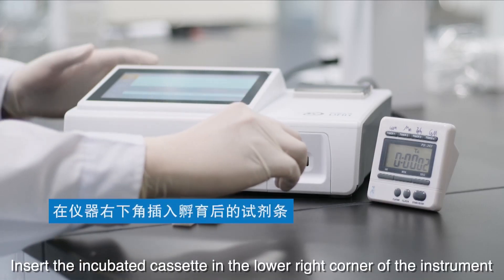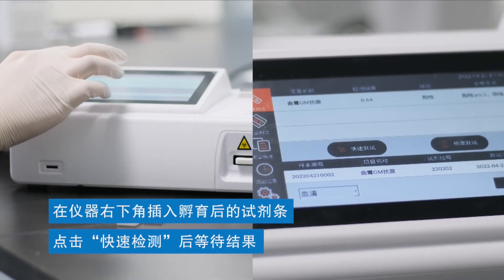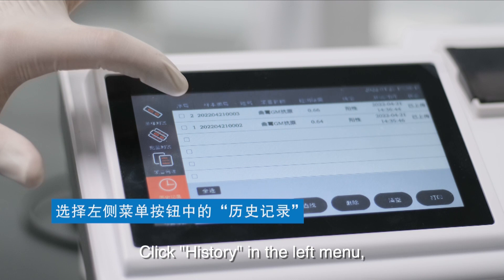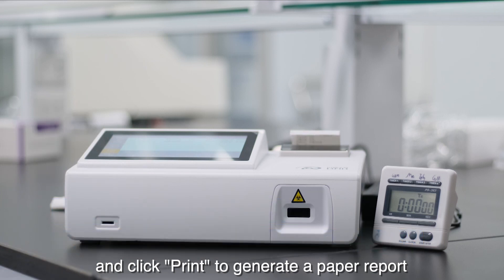Insert the incubated cassette in the lower right corner of the instrument. Click quick test and wait for the result. Click history in the left menu, select the results that need to be printed, and click print to generate a paper report.